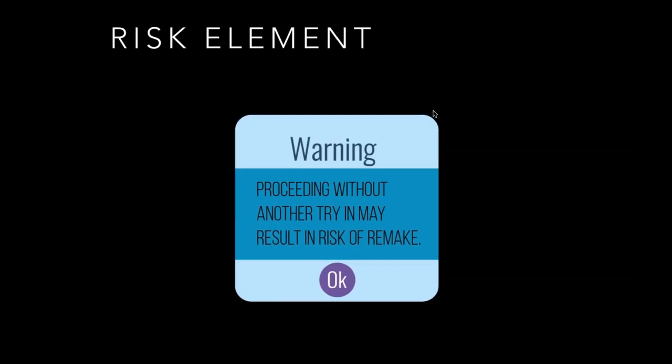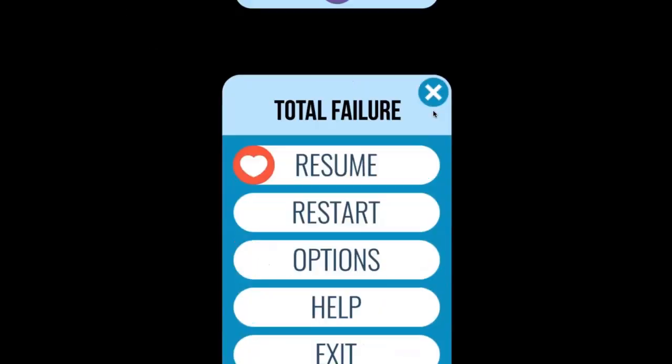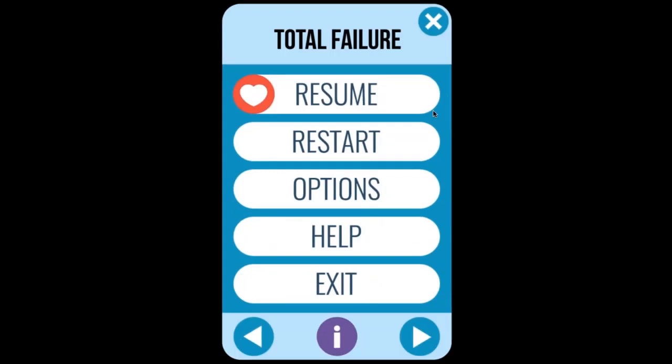There is an element of risk to playing the denture game. If you see your denture at try-in and you think, I just need to change the midline by 1.5, and I think that is going to be perfect, I'm going to go ahead and order the final, there's a risk that you might not get it right. You might have to order a remake. However, what is the worst case that could happen if you make a final denture and it's not exactly right? All you have to do is use a life and order another one.